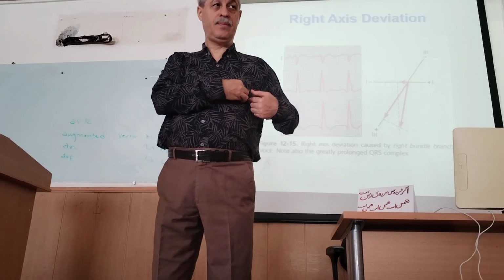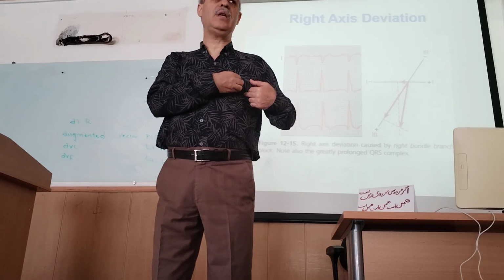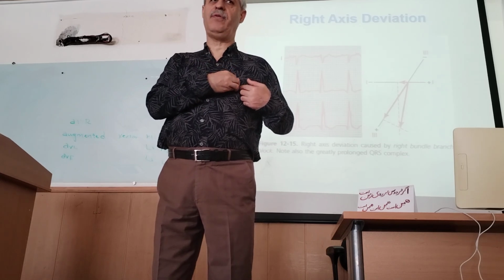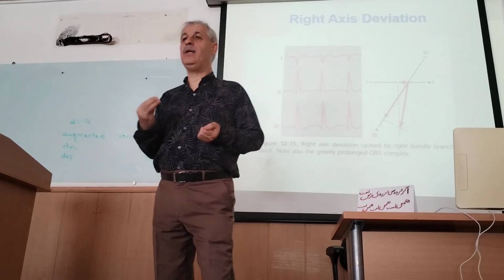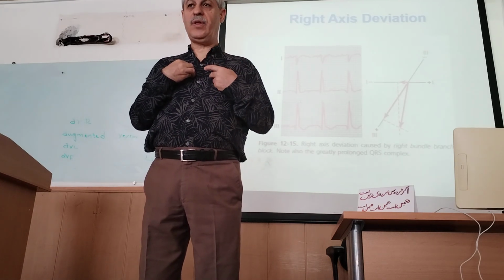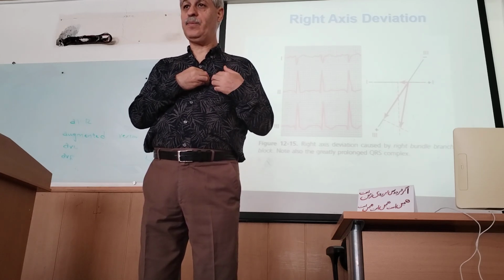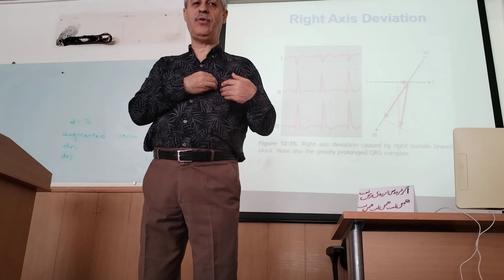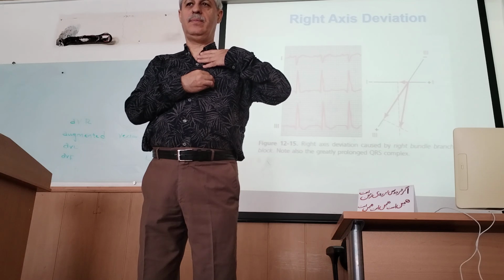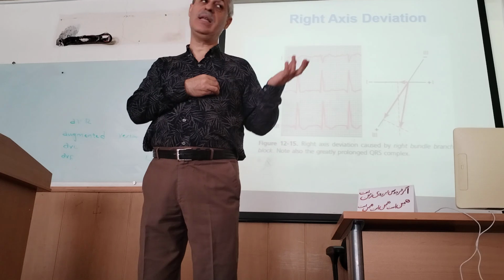Let me repeat it again. Fourth intercostal space at the right sternal border, C1. Fourth intercostal space at the left sternal border, C2. C3 between C2 and C4. Let me correct it: C4 is at the mid-clavicular line intersection at the fifth intercostal space on the left side.